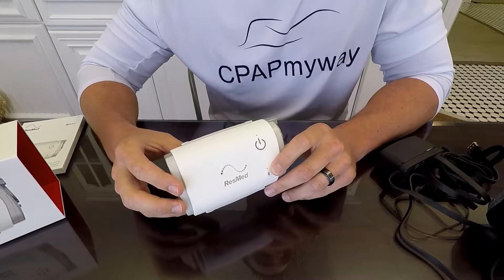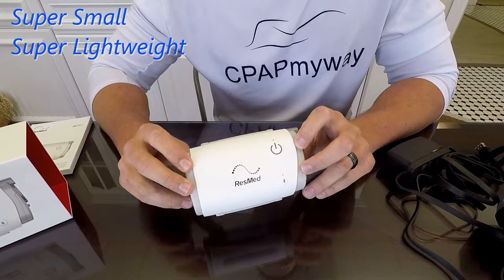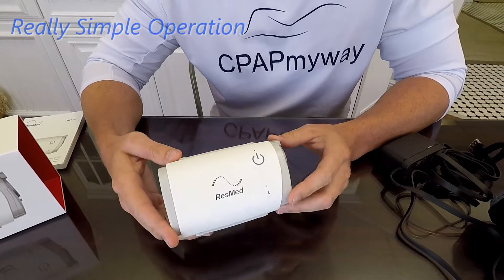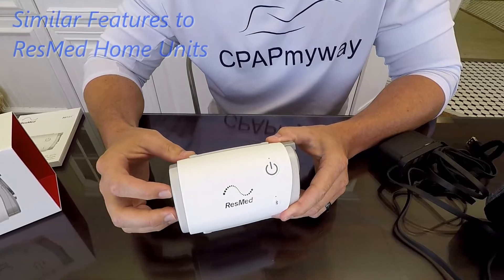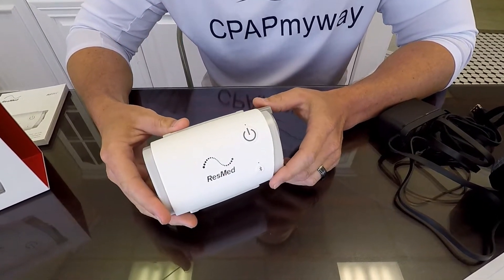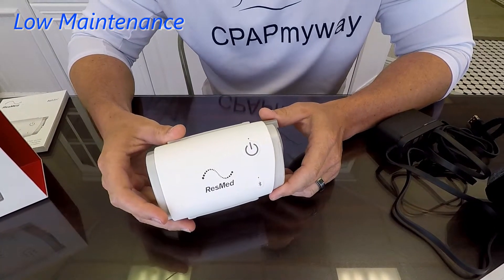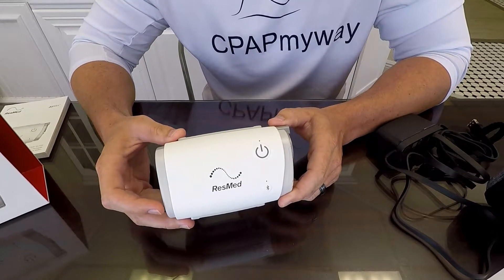The pros of the Air Mini are obviously the size and the weight — that really is just about unbeatable. The thing about sits in the palm of your hand, and if you're traveling, you're not going to notice it in carry-on luggage for sure. The ease of use is also really cool. If you enable the auto start and auto stop features, really all you've got to do is get it out, plug it in, hook up your tubing, and just start breathing. It turns on automatically and turns off when you take the mask off. Very little maintenance — no heated humidifier means no maintaining water.